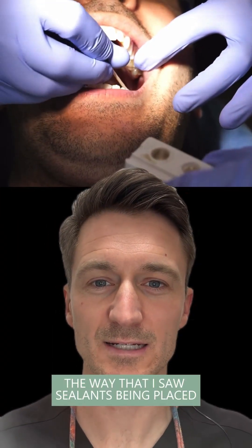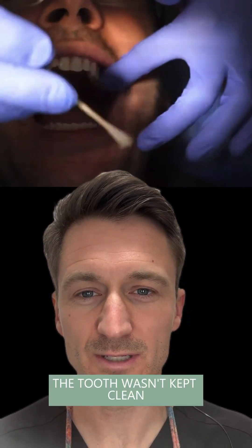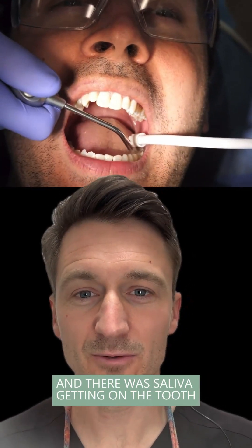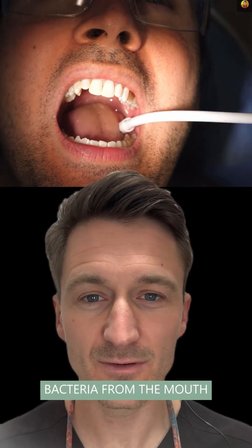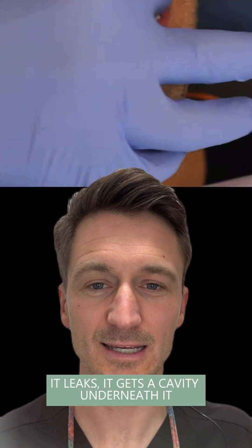I used to be frustrated by the way I saw sealants being placed — it was haphazardly done. The tooth wasn't kept clean, the tooth wasn't even cleaned well to begin with, and then there was saliva getting on the tooth and bacteria from the mouth, and the sealant was placed contaminated.